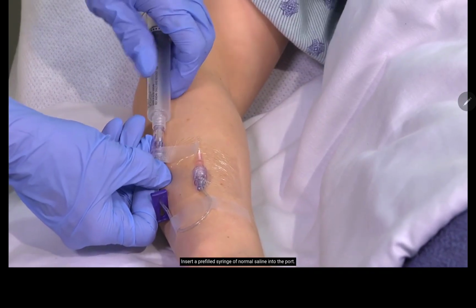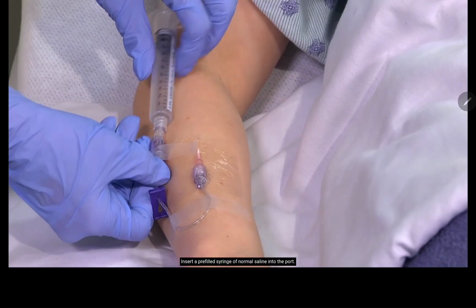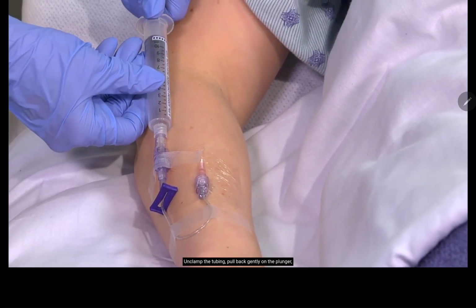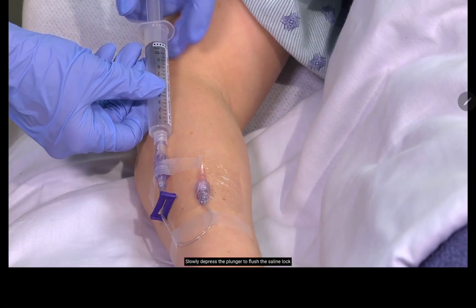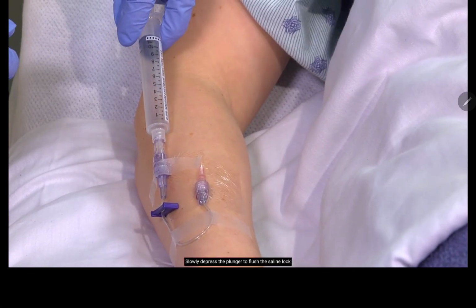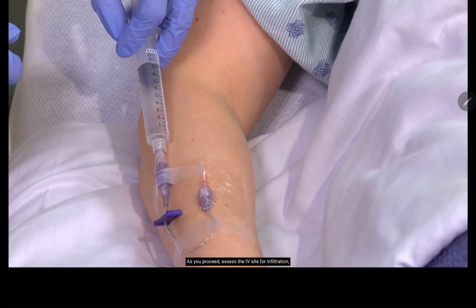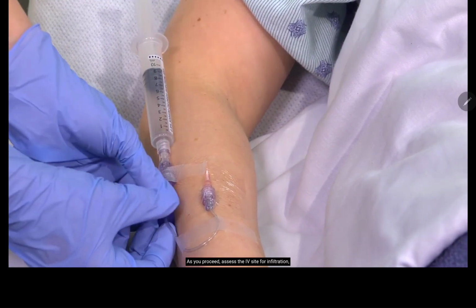Insert a pre-filled syringe of normal saline into the port. Unclamp the tubing, pull back gently on the plunger, and check for blood return. Slowly depress the plunger to flush the saline lock with 2 to 3 milliliters of normal saline. As you proceed, assess the IV site for infiltration.